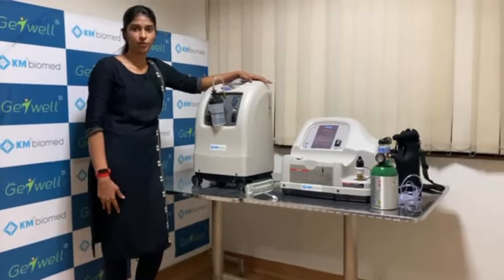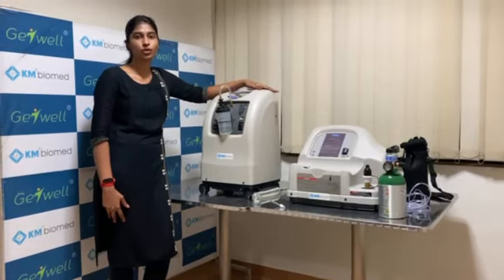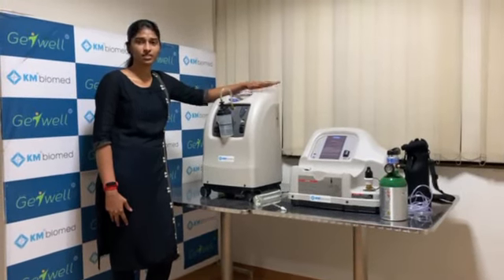Hello everyone. I am from KM Biomed. We are one of the distributors for InvaCare in India. Today I am going to talk about the InvaCare Oxygen Concentrator home fill system.